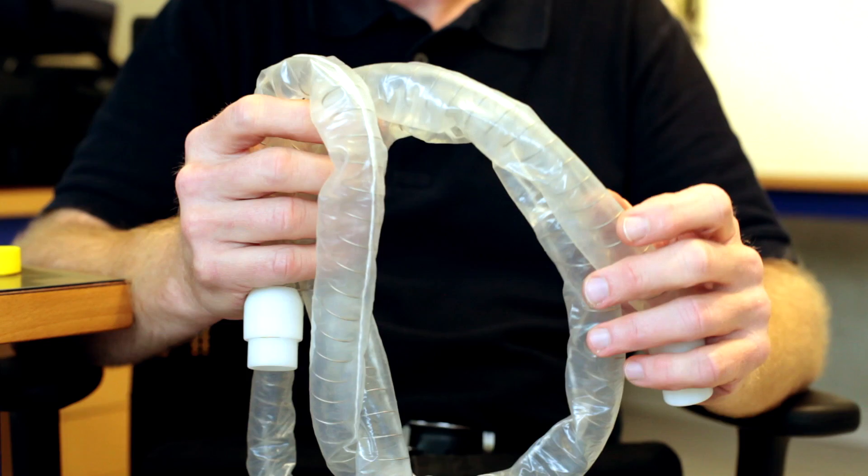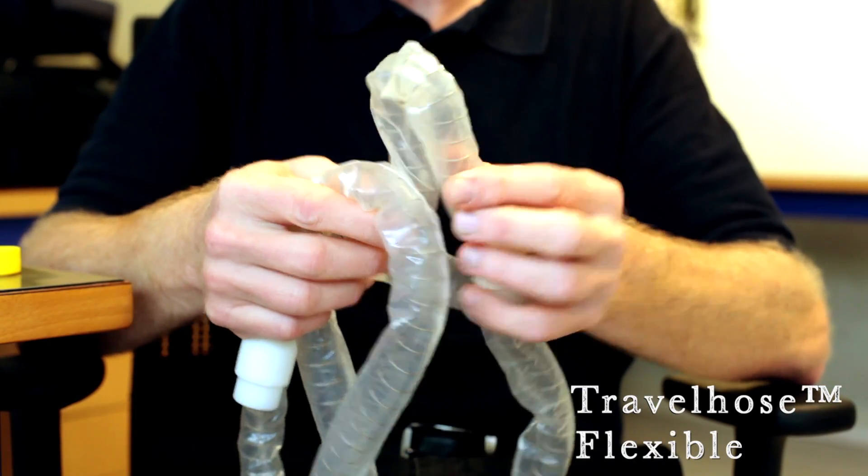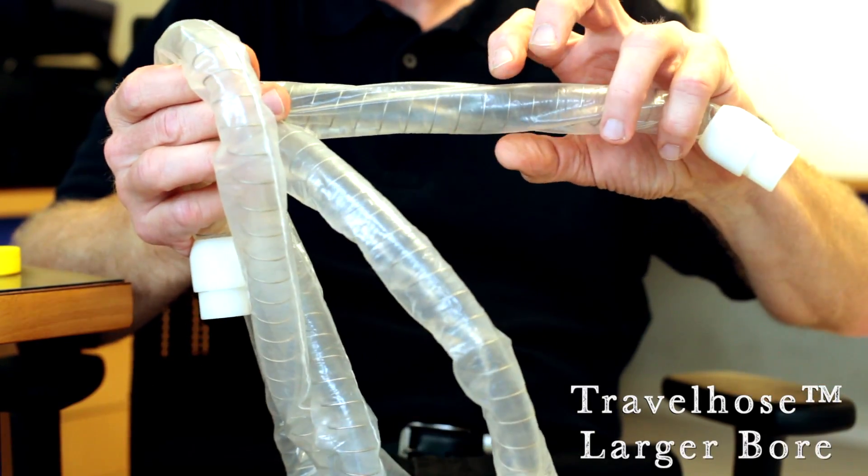Actually, if you have ever been tested in a sleep lab, there's a good chance some of the sensors they used were designed by me. When I realized how problematic the standard hose was for packing and traveling, I decided to invent something better. So I came up with the travel hose — it's very much like the hose you're using except it's a lot lighter, very flexible, and has a larger bore so you get better flow at the mask.